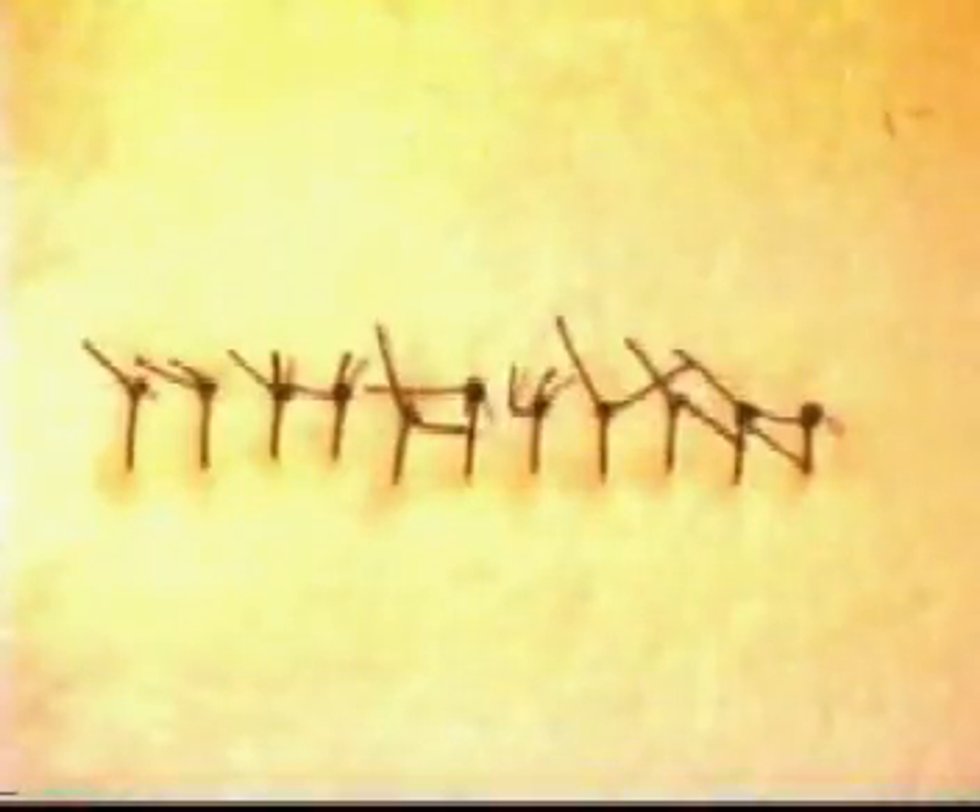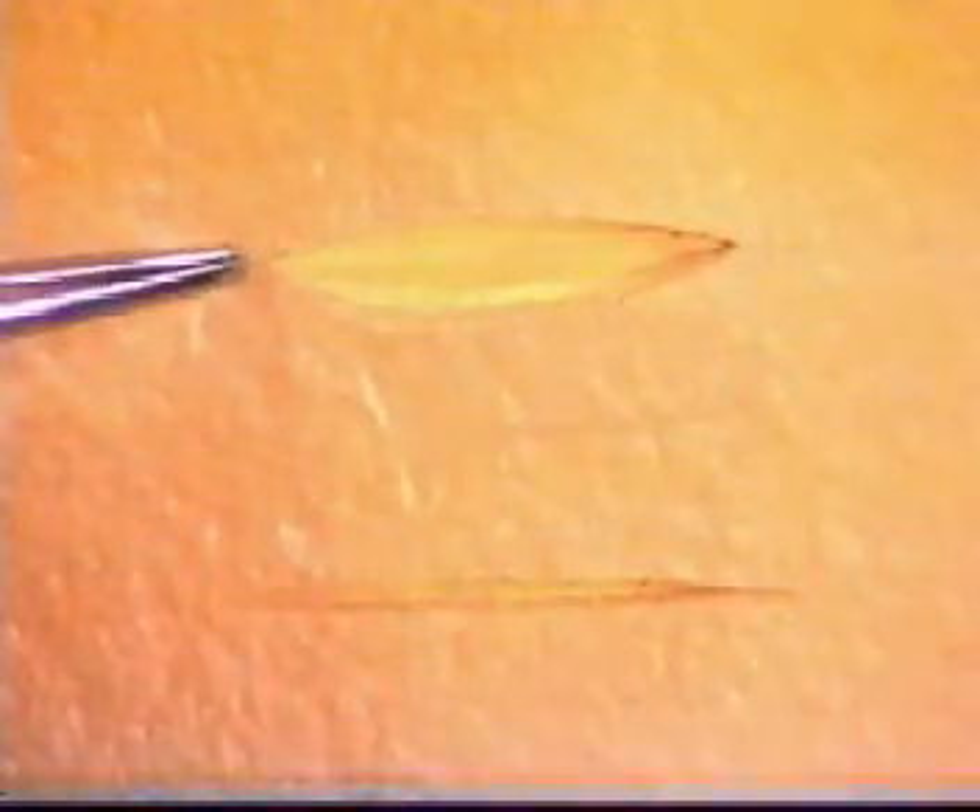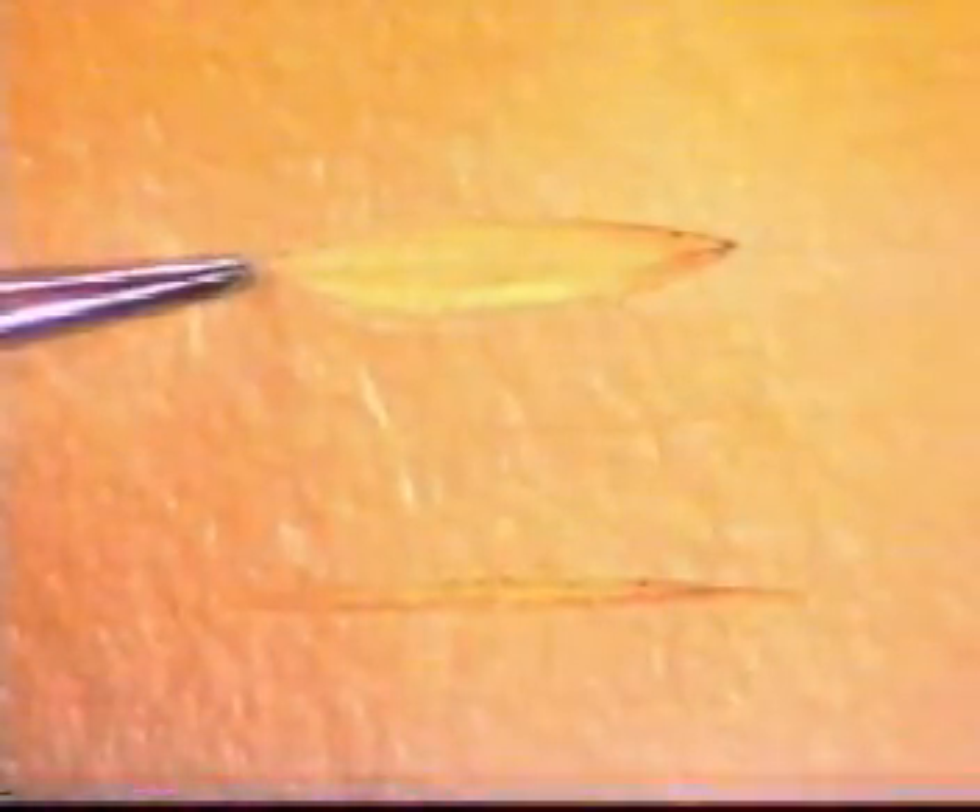Once the wound is closed, ensure that none of the knots lie over the suture line. There may be two types of wound you will be required to close: one, a linear wound, as you see here; the other, an elliptical wound.